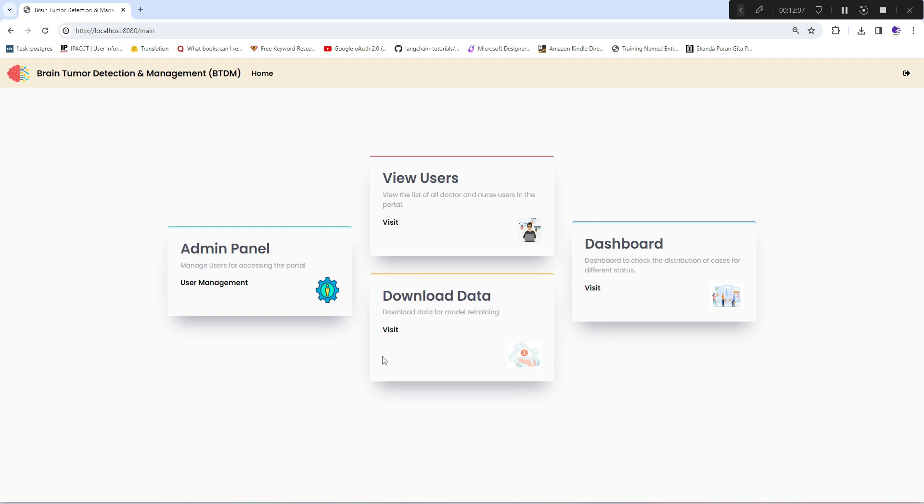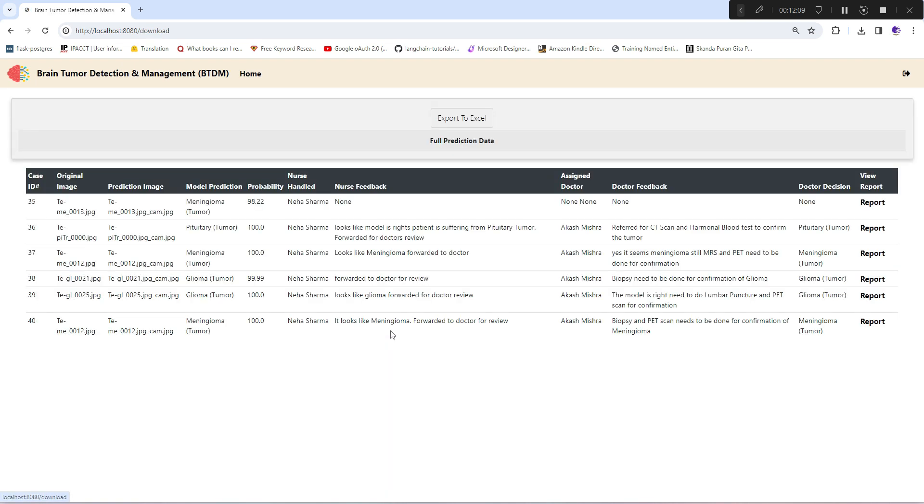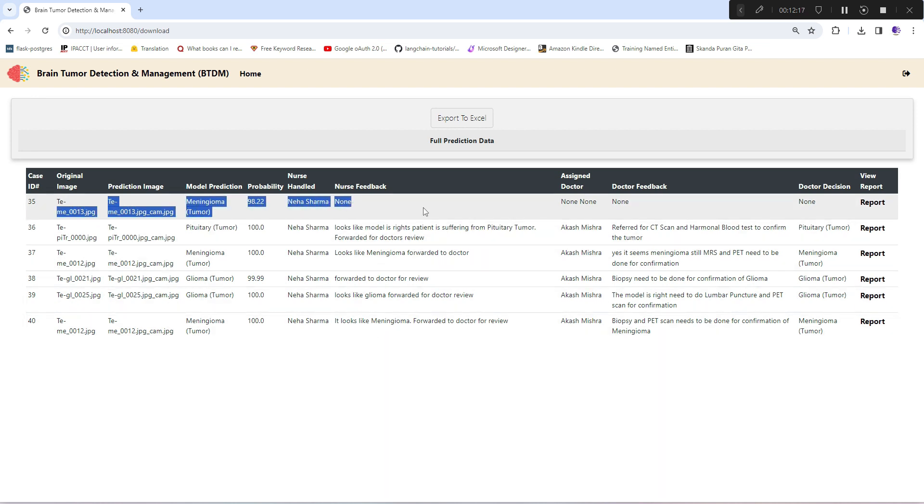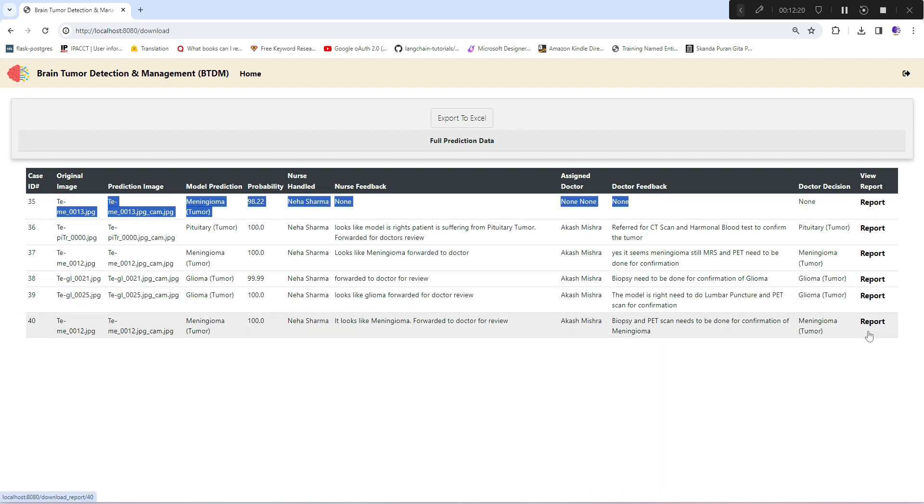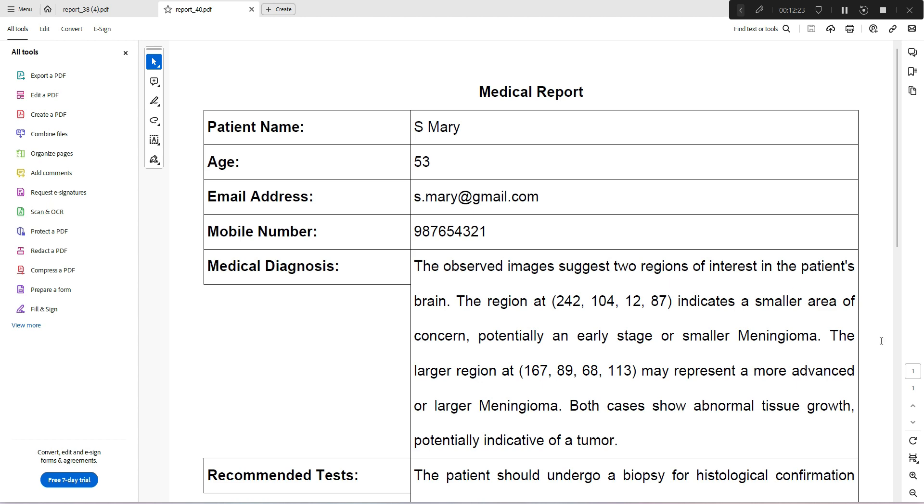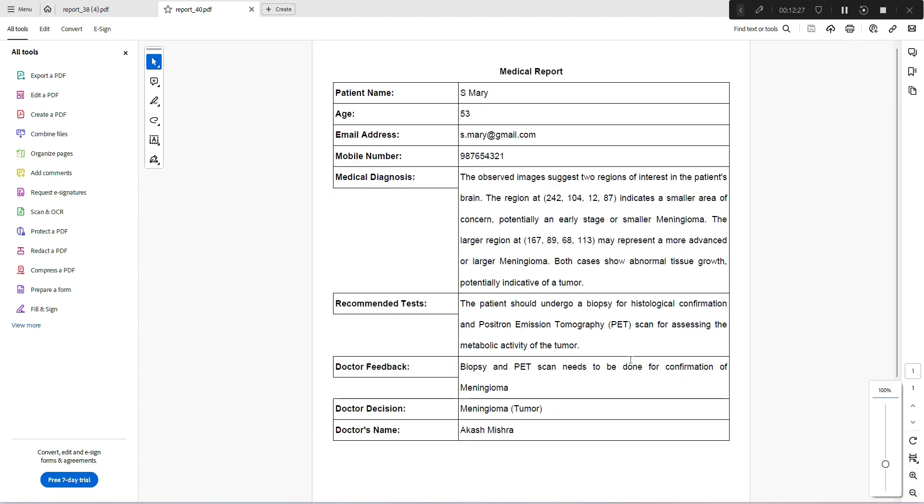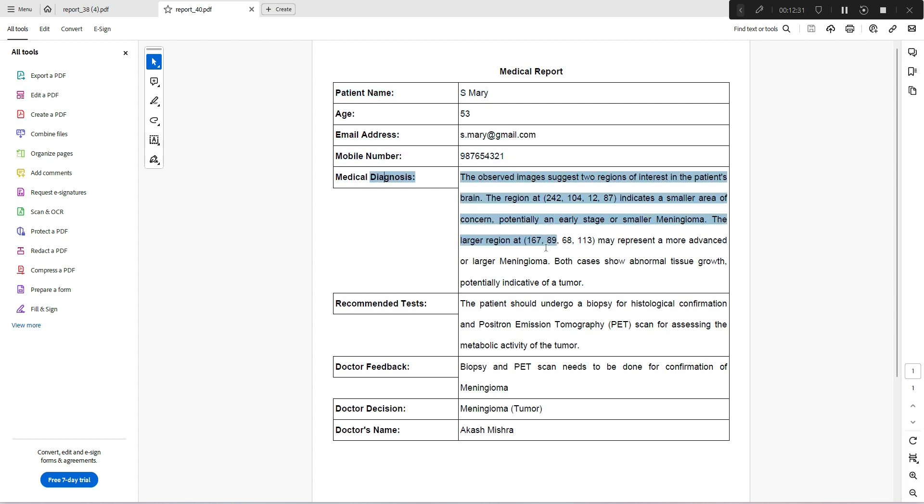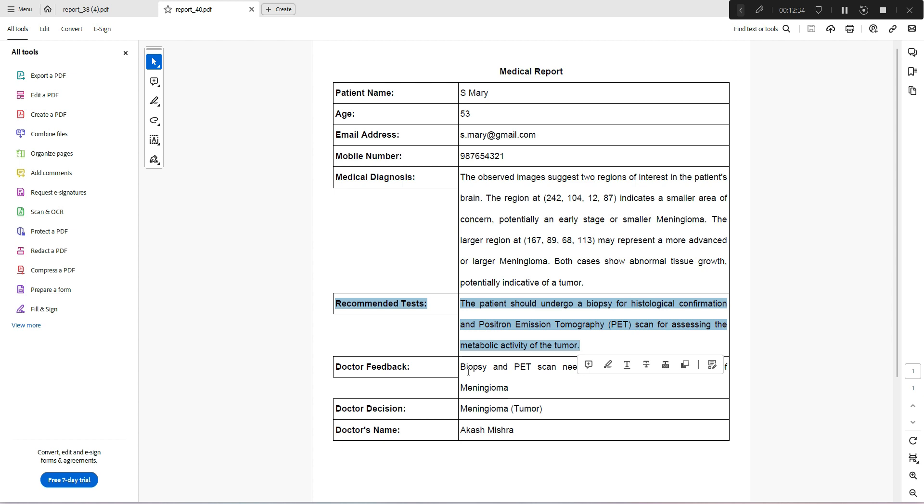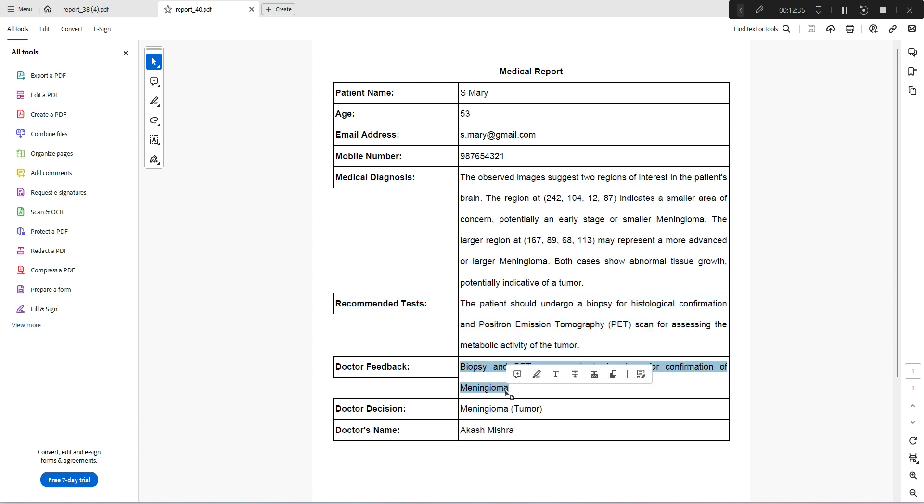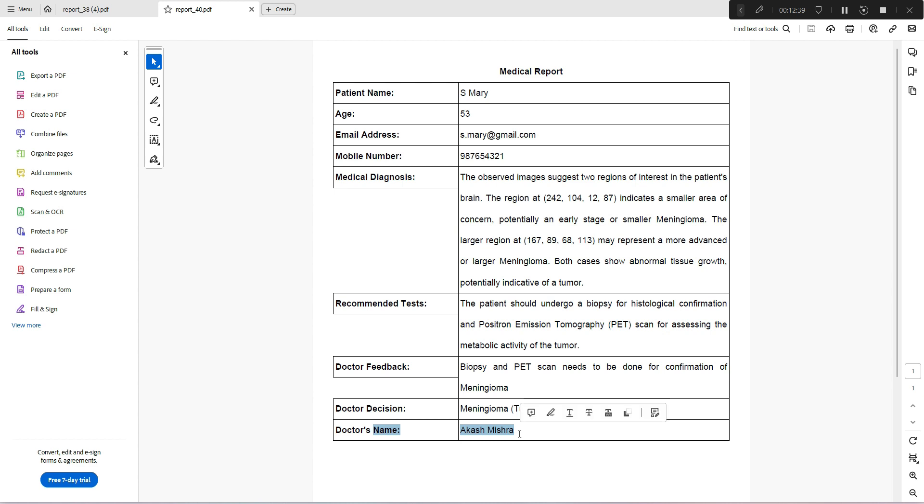The interesting thing is download data. Along with all these details, you can also export the reports. This report shows patient details along with medical diagnosis, recommended tests, doctor feedback, doctor's decision, and the doctor's name. This report is quite standard and admin can share this to a specific patient if needed.